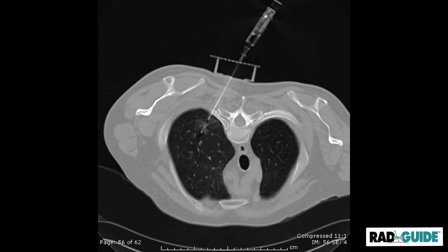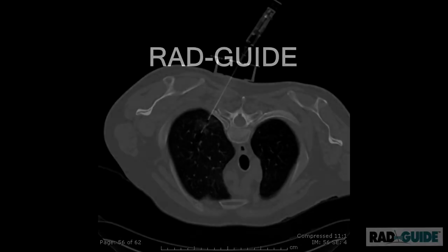The sample obtained with this core biopsy was sufficient to perform the diagnosis of a recurrent bronchioloalveolar carcinoma. This case illustrates how a lung biopsy can be very quickly performed in a few simple steps using the RAD-GUIDE.